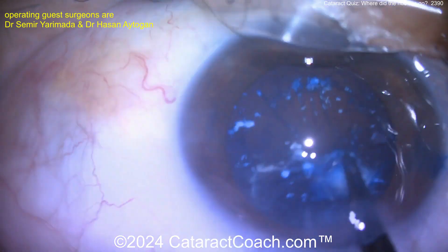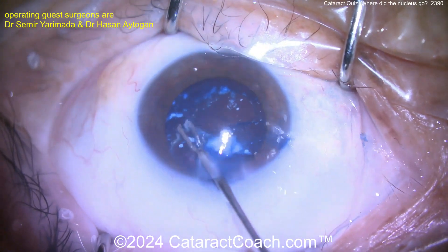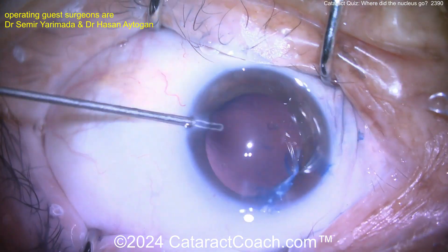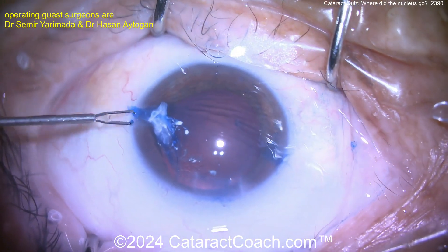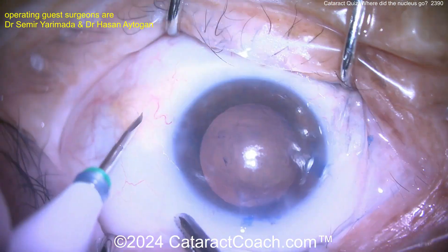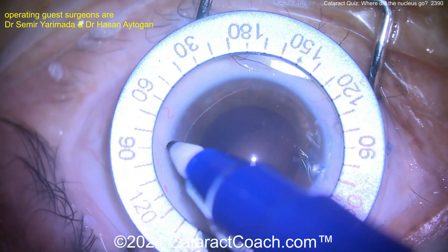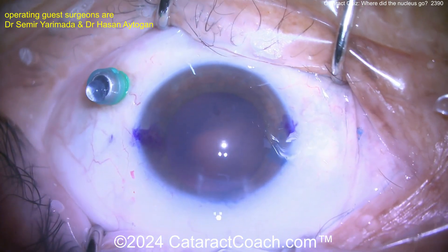Whoa — what is going on here? The entire lens is liquefied. Just get rid of the capsule. There is no lens material left. There was a little bit of liquefied lens material in the bag, and now it's easily aspirated. The surgeon looks like they're marking to do a Yamane procedure, with a pars plana port going in.